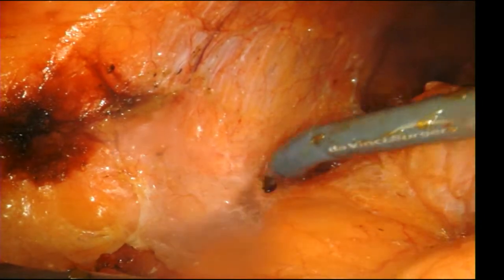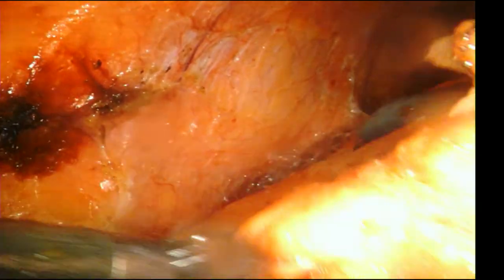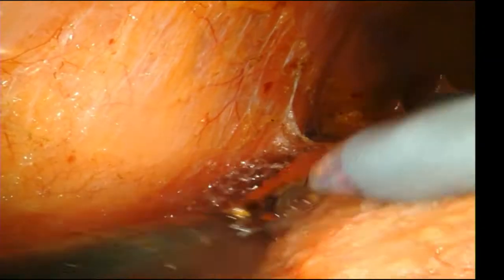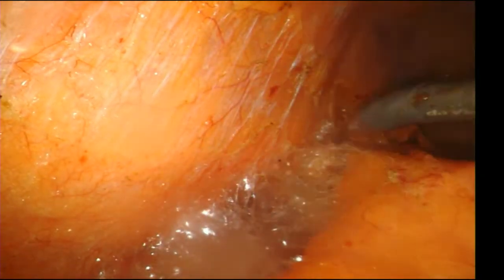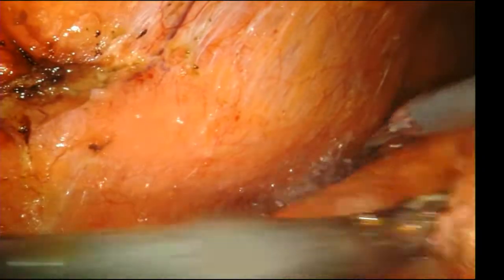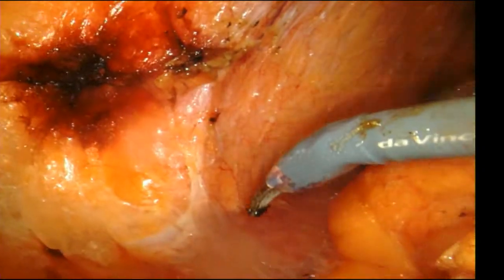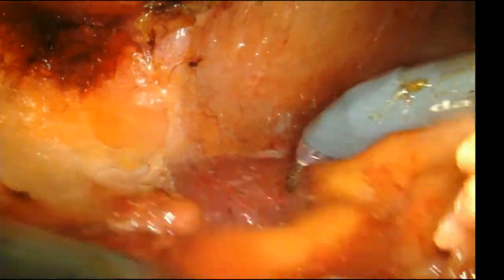If it's hilar posterior, then I'm definitely going to do it retro. Because hilar posterior, doing it trans, even when you flip the kidney, you're still looking over a big hump of kidney to be able to see the backside of the hilum. It's a really hard transperitoneal tumor to do. So that's kind of my thought process in terms of how I decide on whether to do retro or trans.